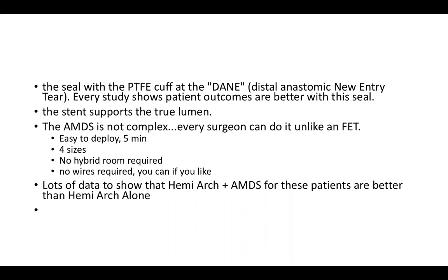And Zlatko, the last guy that we did was a type B with retrograde dissection. Do you have to have the entry tear somewhere in the proximal aorta to be able to use the AMDS stent? I think so. In that scenario, this patient was a little different, and he was elderly.